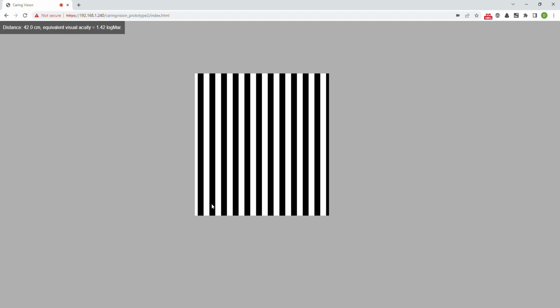So this is the actual assessment, and what you'll see is a series of gratings, black and white gratings, appearing on the screen. The eye is naturally drawn towards the gratings, and as you look at them, you'll notice they start to get smaller, and the reason for that, of course, is because I'm looking at the gratings.